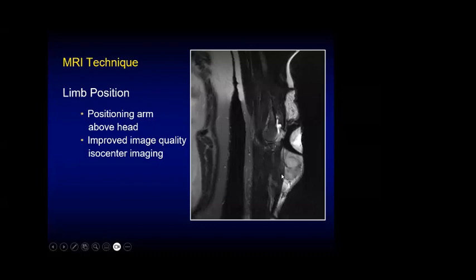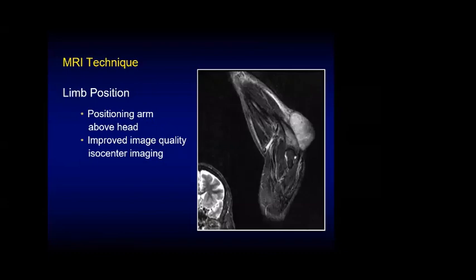So in order to optimize the imaging for this patient, we would normally recommend putting the upper limb in the center of the MRI scanner. In this situation, you will get a more homogeneous magnetic field and therefore better fat suppression and better optimization of the imaging. So this is how positioning of the patient could actually help you improve the image quality of the MRI.